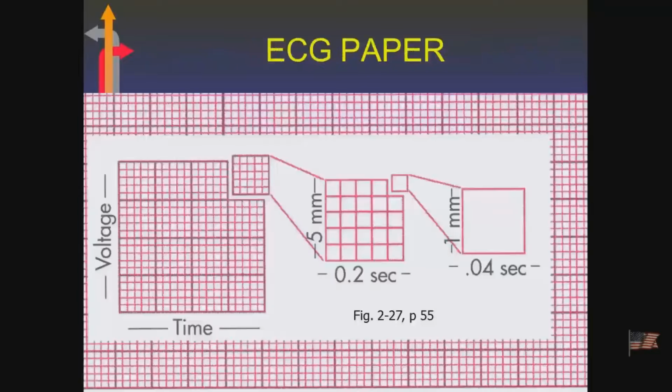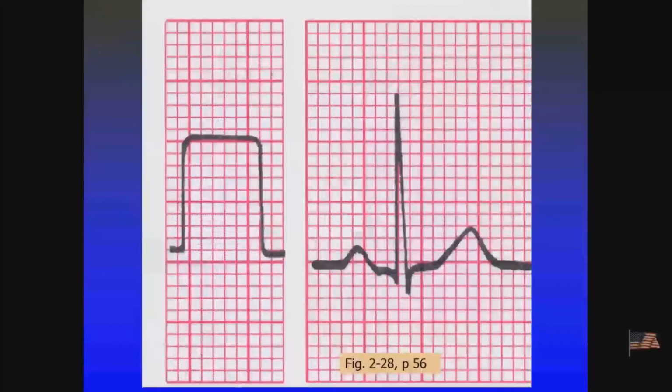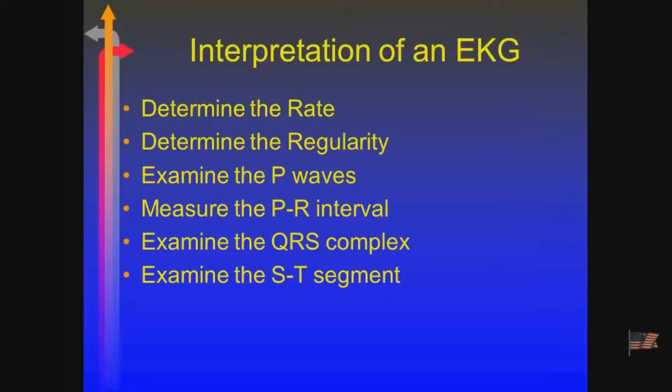Okay. ECG paper, as Mary probably covered with you, the key part is that each one of those little boxes is 0.04 seconds. So if you add 5 of them together, you end up with 0.2 seconds for one of the big boxes. And we're going to use that because we want to distinguish how wide certain aspects of the tracing are. So here we end up seeing what is considered to be a millivolt. It's an electrical test that they end up doing. But here's your ECG tracing that you end up having as it sits there.